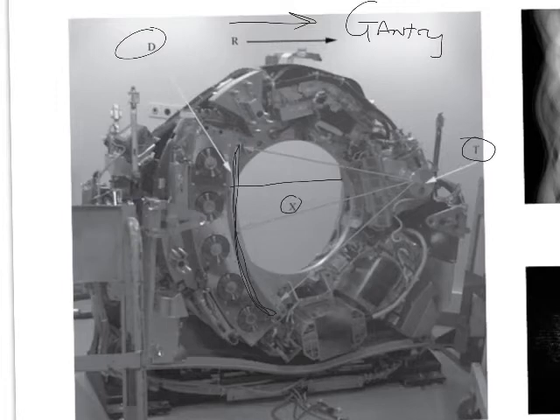So we indicated that there's a tube. There's also a generator, a high voltage generator, and I'm not exactly certain, but I think some of this junk down in here is high voltage generators. So in addition to something that could shred you, you have something that could electrify you to death spinning around the patient, plus something that could irradiate you and make you sterile. So it's really an exciting advent in history when we came up with this amazing new way to bang rocks together. But it definitely seems pretty intense to me.